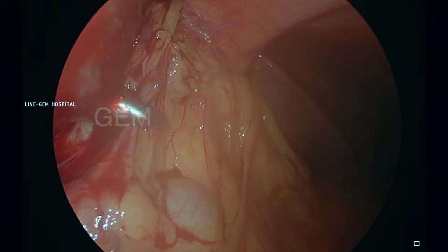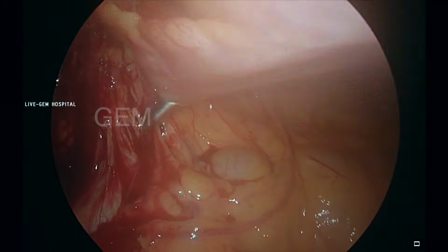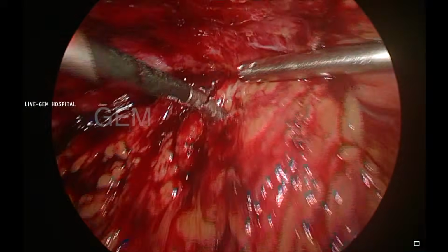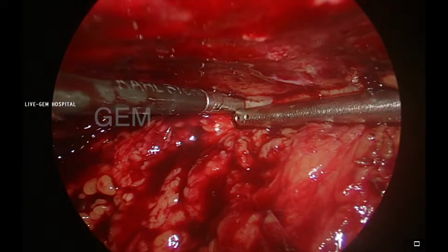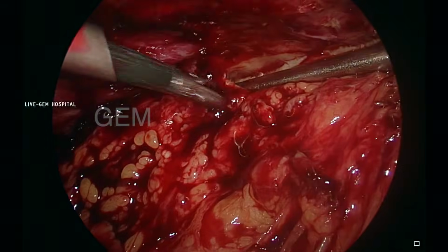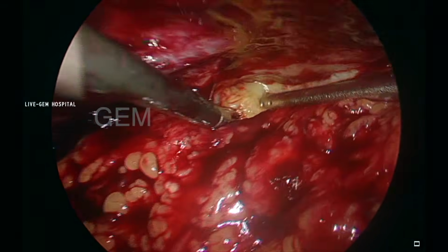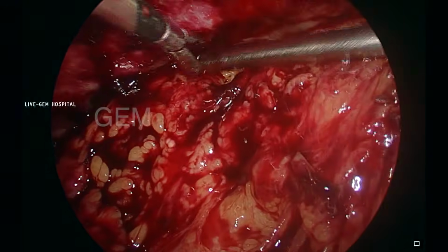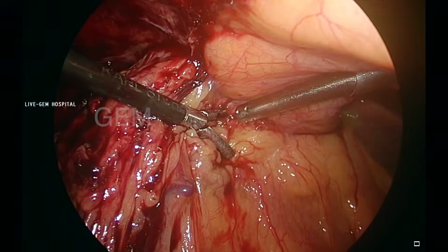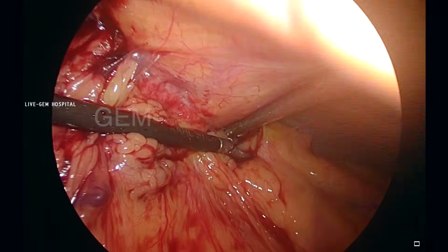So now I have a space to place the right subcostal port, and this is the epigastric port. I put a 5 mm, and at the time of clipping, I change to 10 mm in the epigastric. With the two instruments, I am slowly entering. I have to go between the abdominal wall and the omentum. It is very dense adhesions, late presentation, and there is a huge abscess cavity. It's clinically a mass, and imaging-wise there is an abscess cavity.